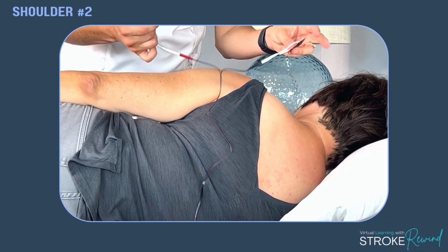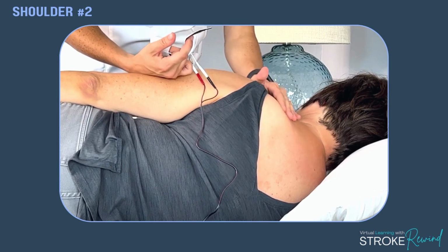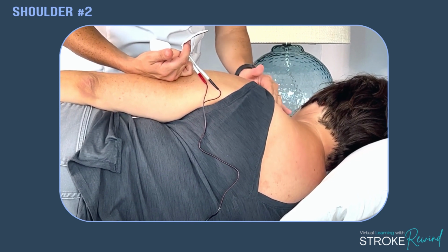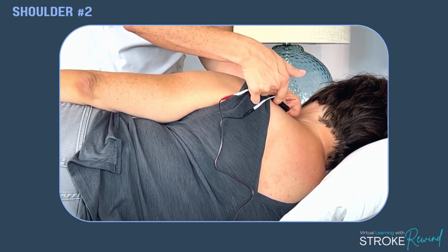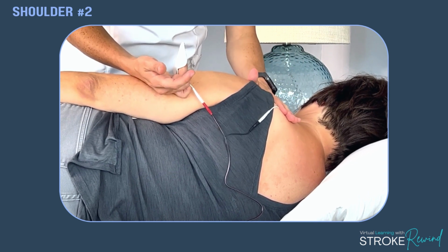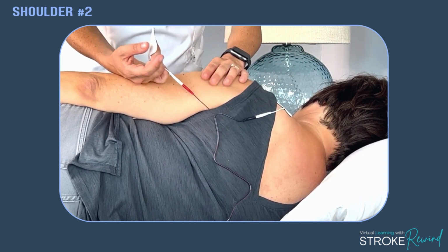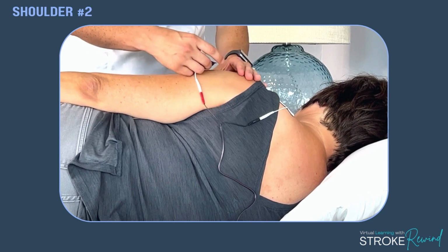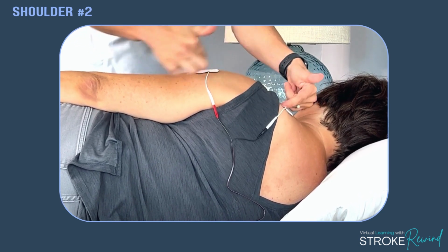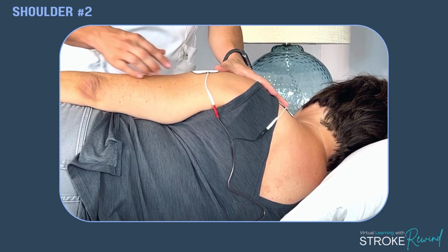The second placement for the shoulder is, again, I always feel for a soft, meaty part. This is super meaty at the top of the shoulder for the muscle. And so you're going to place, I like to do black over red, so I like to put the first electrode here, and the second one I like to find a meaty part of the shoulder over here, so the middle of the arm. So you should see these almost directly across from each other.